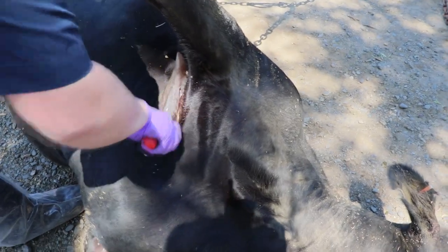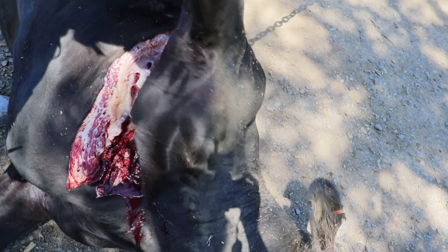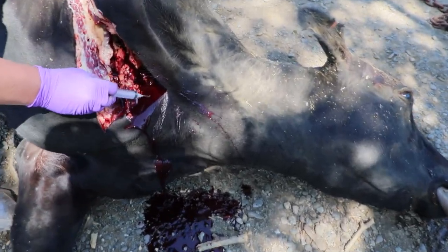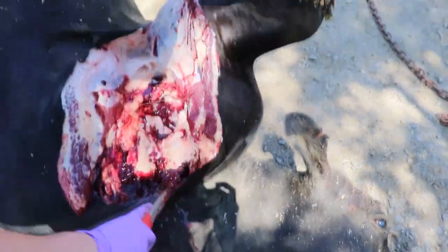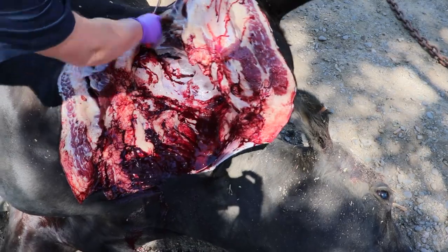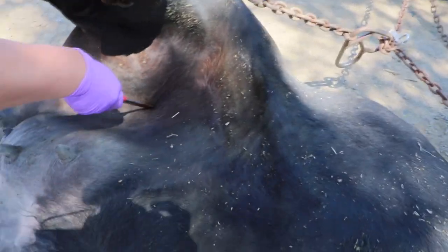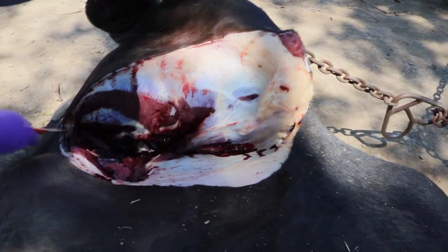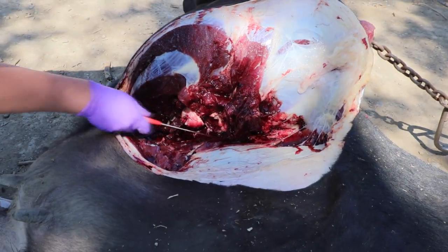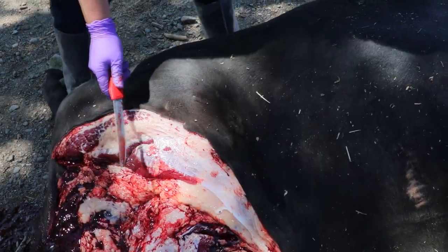You can use your body to lift the leg in order to stab into the axillary joint, but with larger animals this can become tiresome, so we're going to show you another method. Making a stab incision into the axillary. This is a good time to pause to get blood. Then taking a stab into the inguinal region.